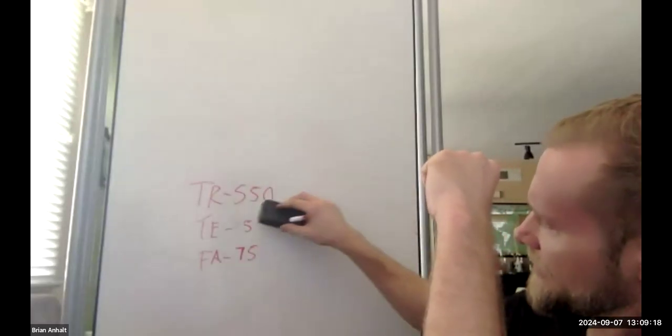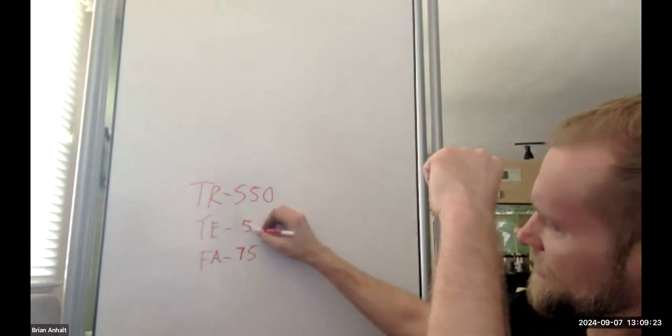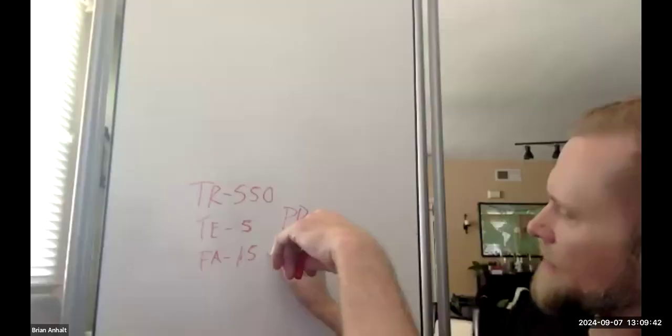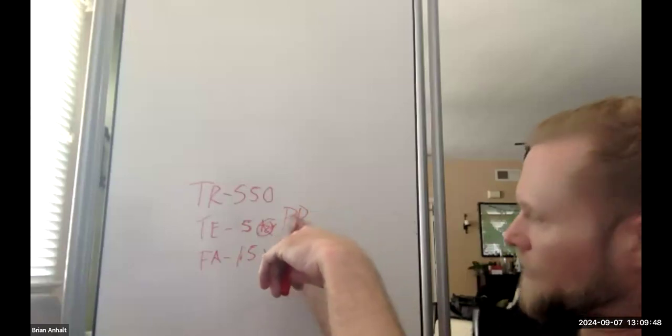We said PD, didn't we? That's T1 weighted. We want PD. How do we do PD? Lower the flip angle. Minimizing T1, minimizing T2 star, proton density.